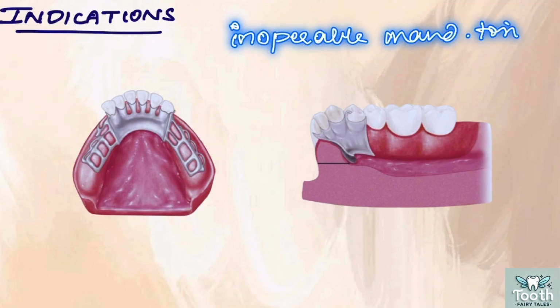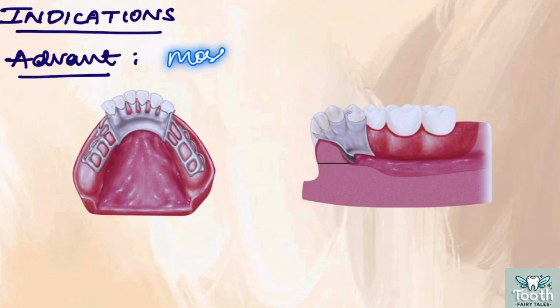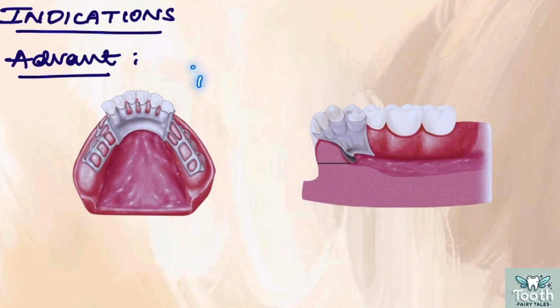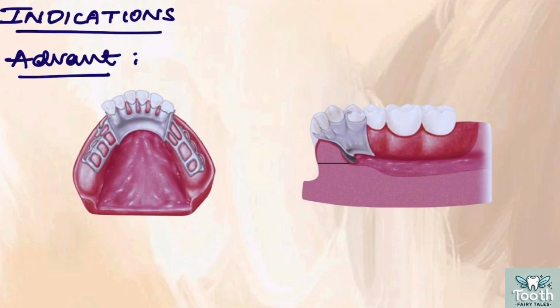What are the advantages of the lingual plate? Lingual plate is more rigid and it provides good support and stabilization. It provides indirect retention because it has the rests on the premolars. It also provides better patient comfort and phonetics.